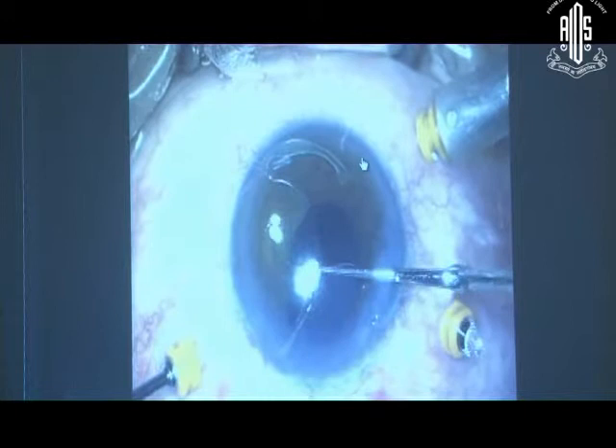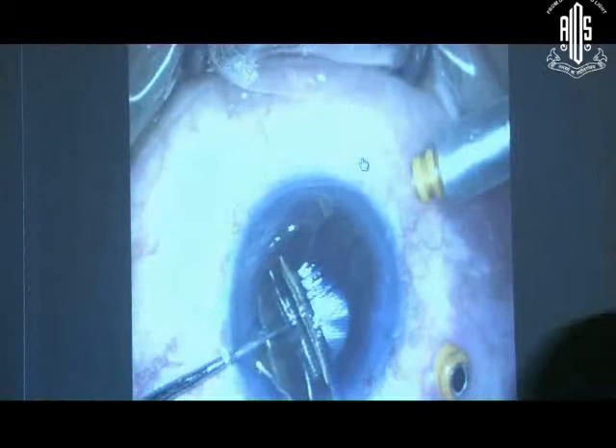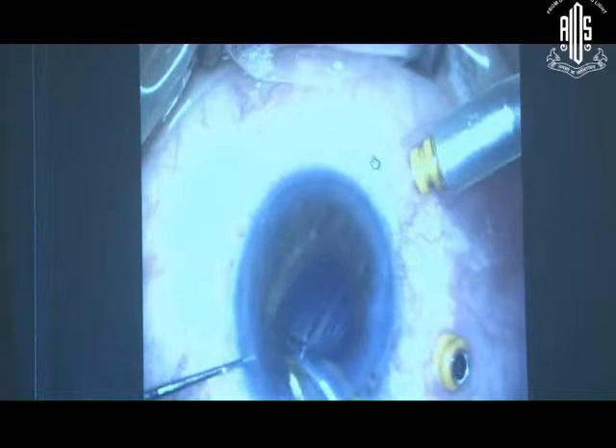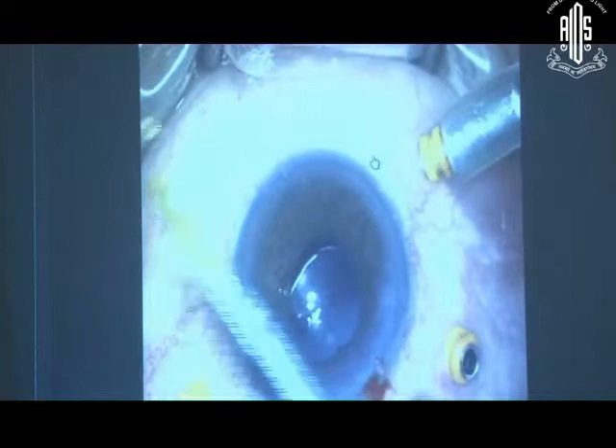Then with the holder-folder and the dialer, you depress the center of the foldable lens, fold it, and take it out through the incision. Then you can put the lens again inside and put this lens back into position.